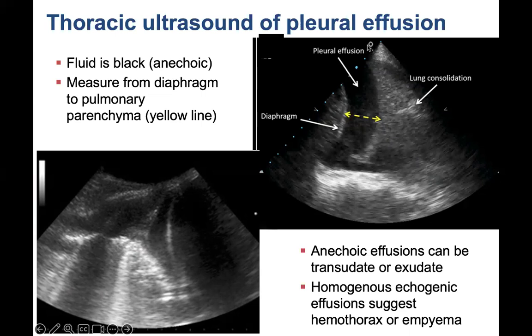Generally, you'll be in body mode with the indicator on the left side of the screen, and the indicator should be towards the patient's head. So this picture right here is actually swapped from how you should ideally see the picture, but sometimes people will take them that way.